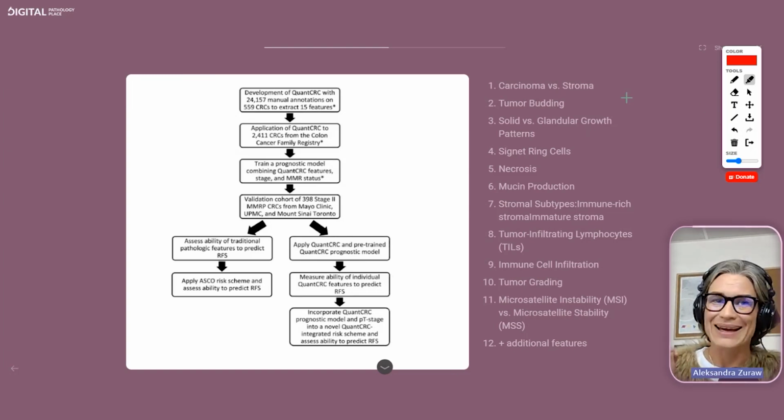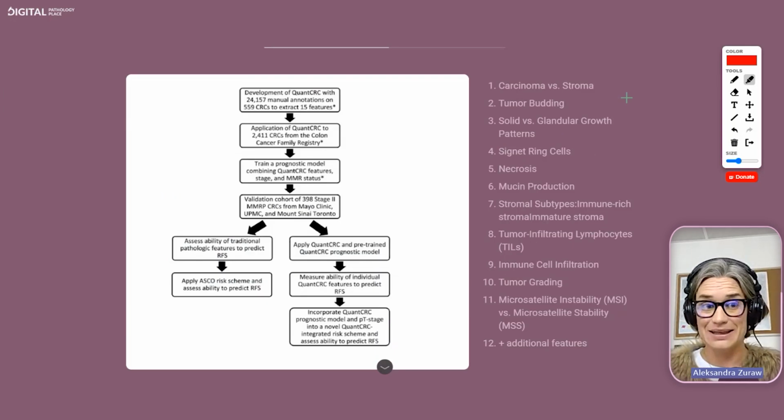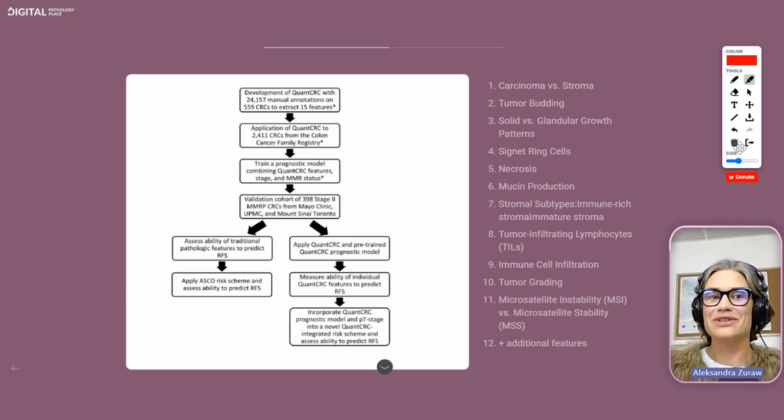Mm-hmm. So it was an interesting way. I don't have an image for that, but what they did, let me draw it for you. So usually you just give examples of structures in the tissue. Everything that's here other than the instability is image data. And then what they did, they annotated the whole image and gave it a label, stable or unstable.